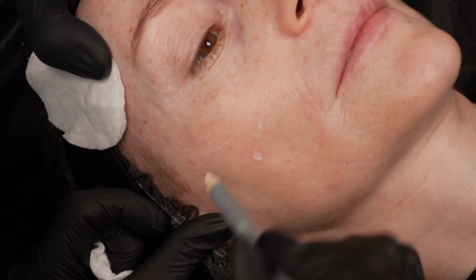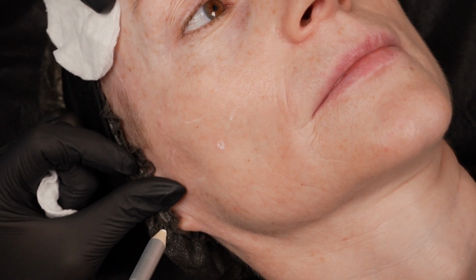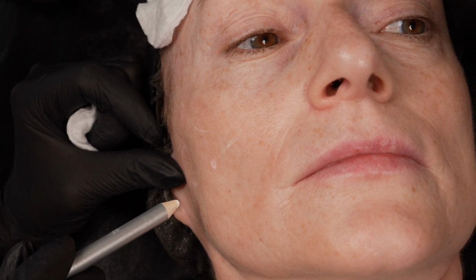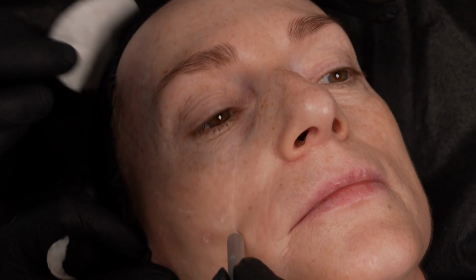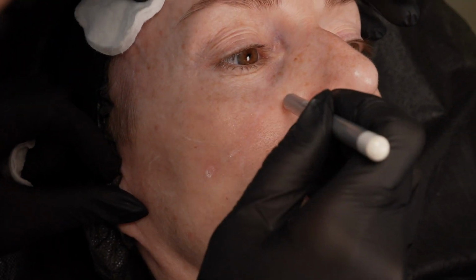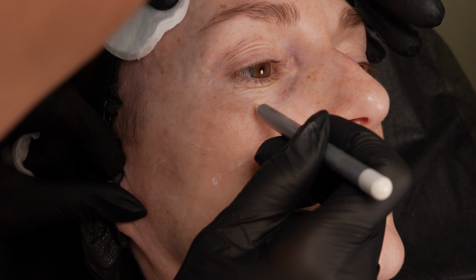Но я бы еще хотела проработать вот эту ямку. Это уже поверхностно. Давайте сейчас мы с этим. Ага. Ну, в принципе, с этой точки вы тоже достанете. И дальше закончите, и я переведу доктору. Угу. Ну, в принципе, все. Вот если бы я отсюда зашла, я бы проработала именно зону средней трети. Но вот эту часть я бы, конечно, не затрагивала, потому что здесь у нас носогубный жировой пакет. Да, именно вот эта часть.